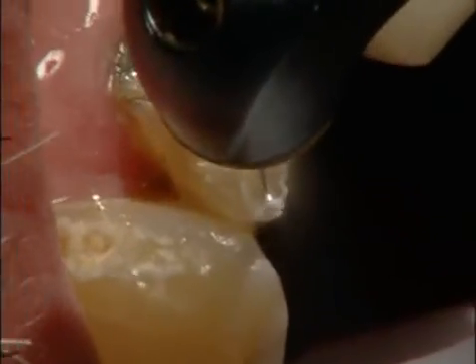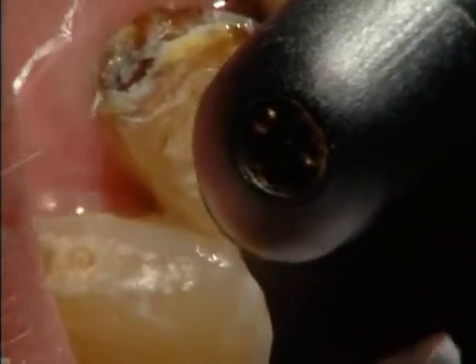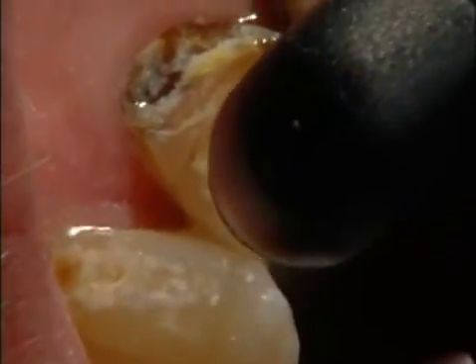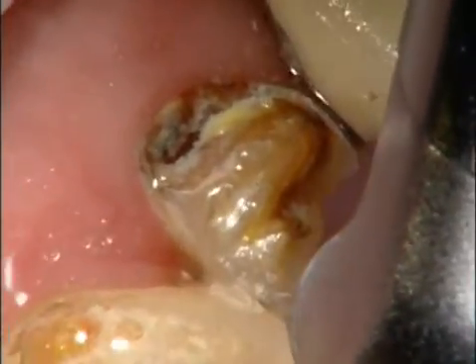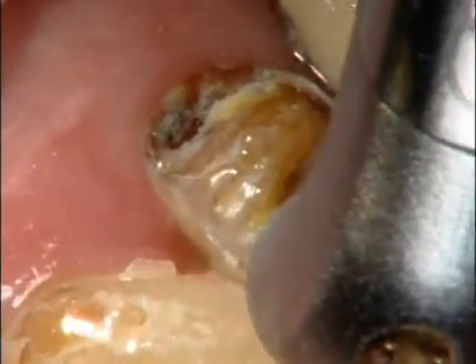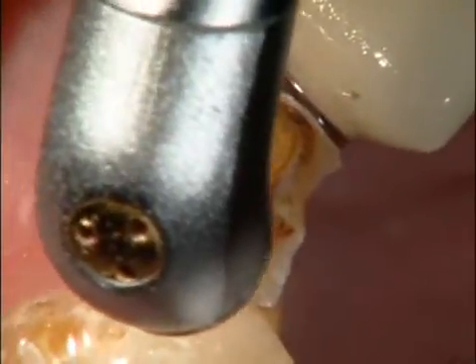Once the occlusal is reduced, that exposes the dentin enamel junction. If you put the G6 tip about 0.5 millimeter away from the enamel, it will fairly rapidly remove the enamel, and it will allow you to place a chamfer margin. Like on Dennis, we did an all porcelain bonded crown. So I had a nice chamfer margin, which you'll see here as we proceed.